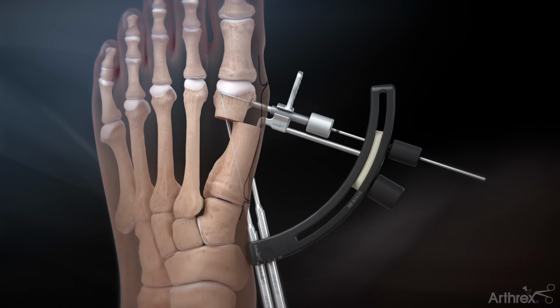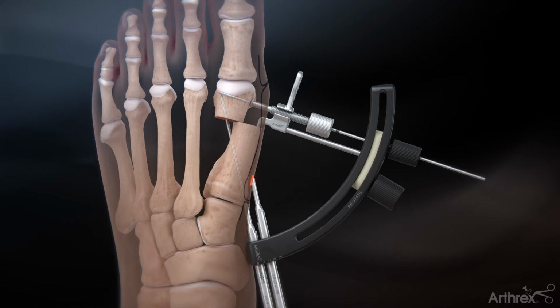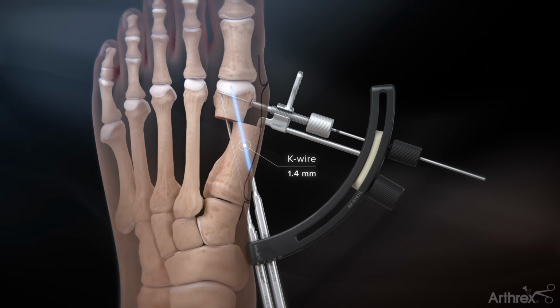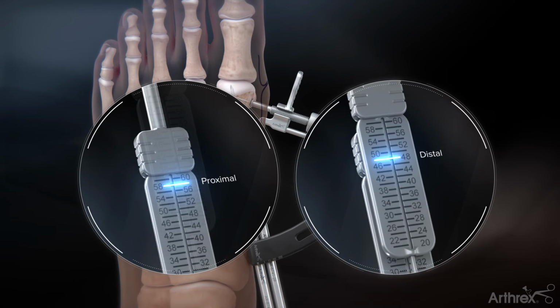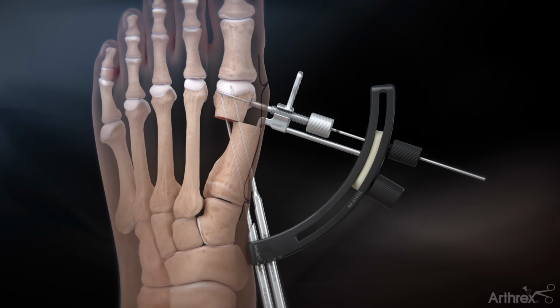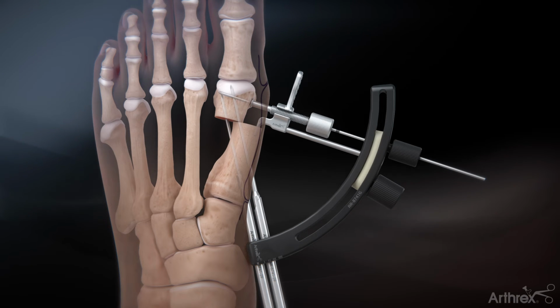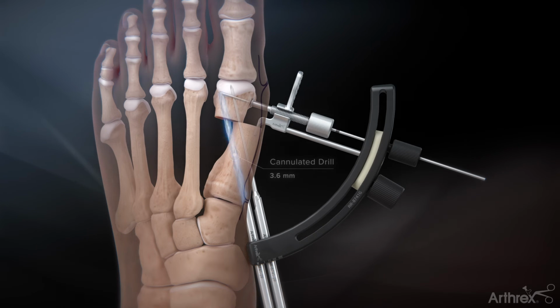With a stab incision, advance the sleeve down to bone in a similar fashion to the first sleeve. Advance a K-wire through the sleeve for the distal screw placement. Using the depth gauge, record the measured screw length from the laser marking on the guide wire. Remove the depth device, leaving the drill guide in place, and insert the cannulated drill over the proximal guide wire. Ensure that the drill is advanced over the complete length of the screw into the capital fragment.